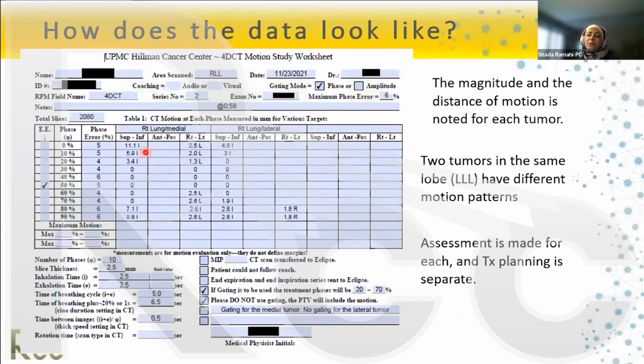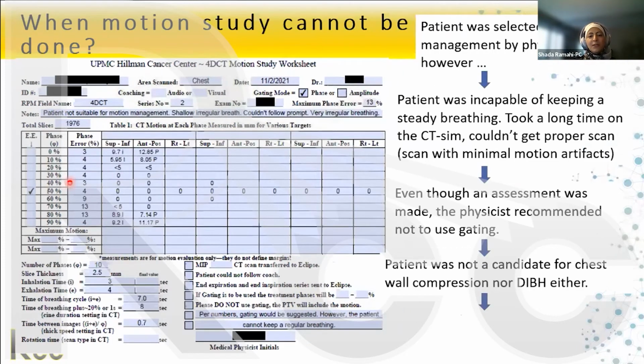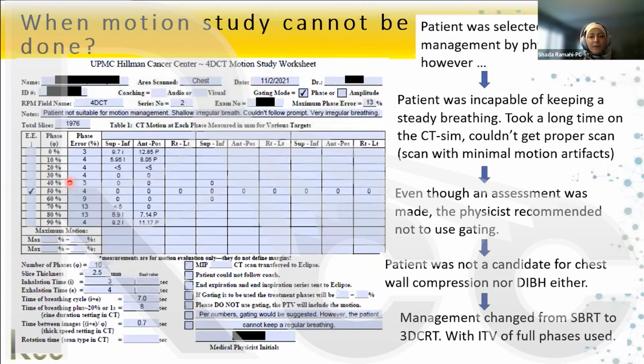Relative to what? Relative to 50% phase. So 50% phase is our reference. Okay? But all these motions are relative to phase 50%, which we said is full exhalation.